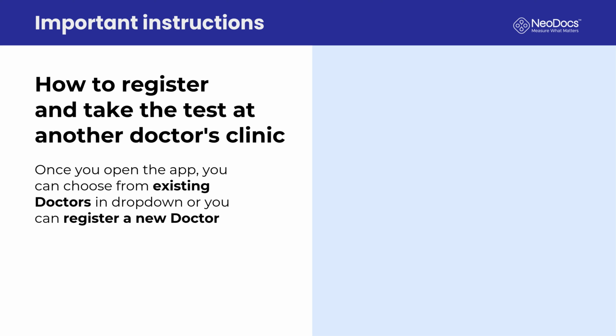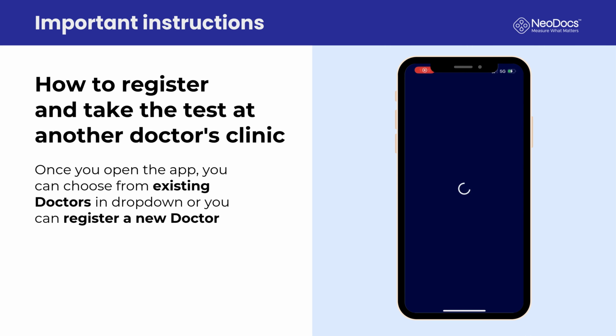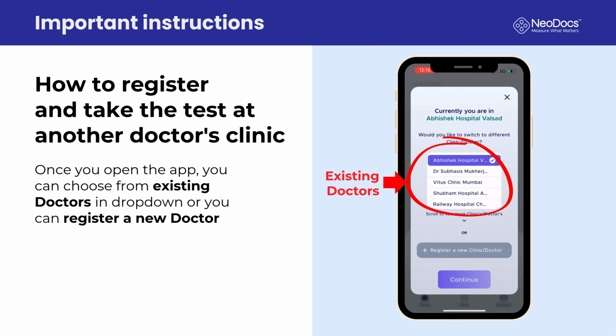Let's understand how to register and take the test at another doctor's clinic. Once you open the app, you can choose from existing doctors from the list or you can register a new doctor.